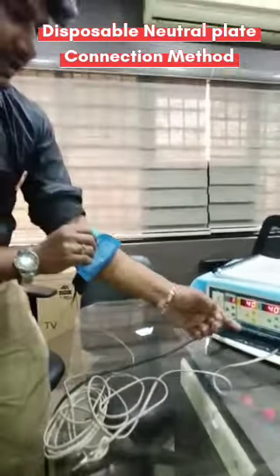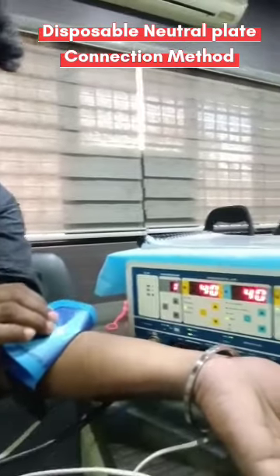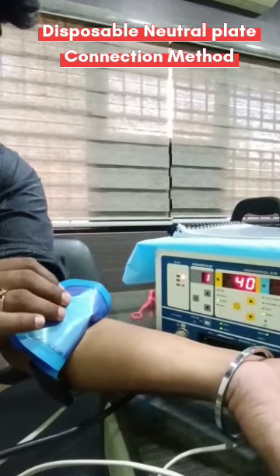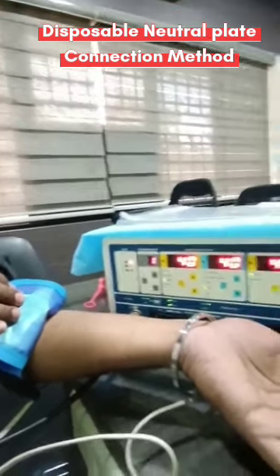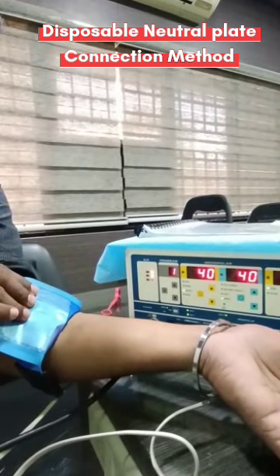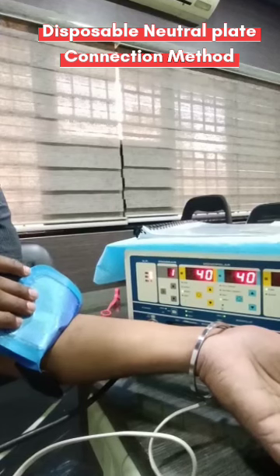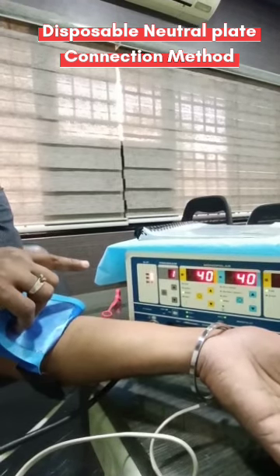Here you can see the safety indication. I'm going to remove it partially — see that the first level indication comes. The first level indicates the patient plate is partially removed. Then if I keep on removing, the second level indication appears. If the percentage of removal is more than 50%, the second level alarm will automatically come.